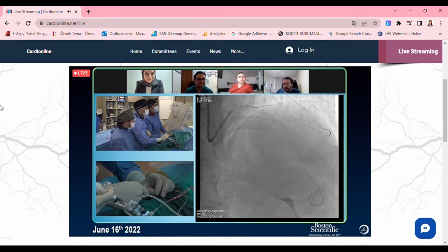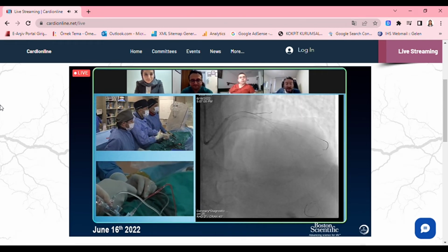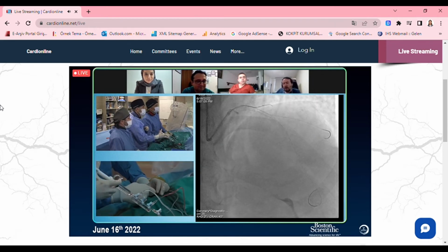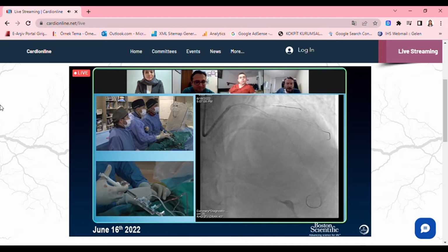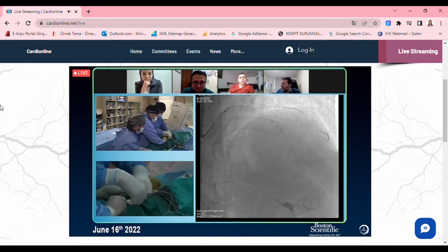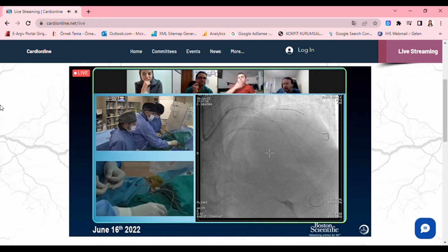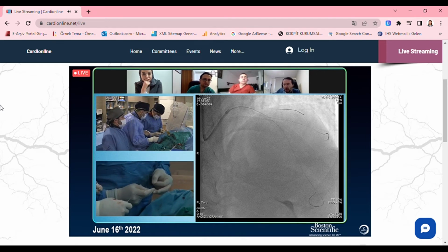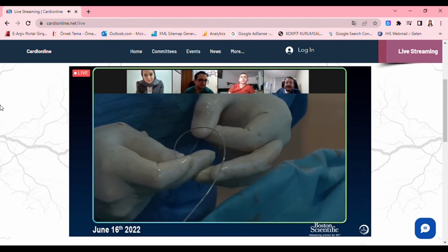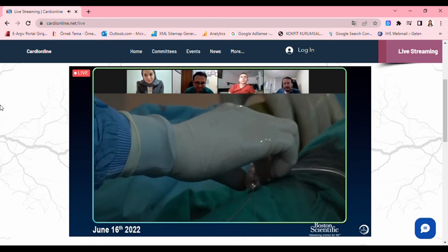By me it's up to my mood. If I want to work in a more aggressive manner, then I definitely go with the pacemaker. If this is a big RCA, and I'm going with a 2.0 burr and want more debulking rather than modification, then I would go with the pacemaker. But usually with the 1.5 burr, if you work very slowly, you don't need any pacemaker. Of course, you should always be looking at the pressure and the rhythm. That's the key. Essentially both, you haven't really moved away from pacemaker completely. Yeah.